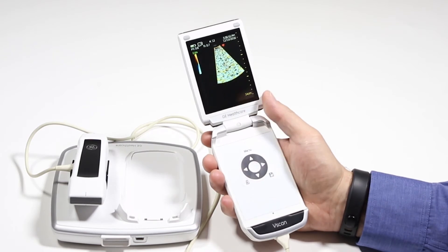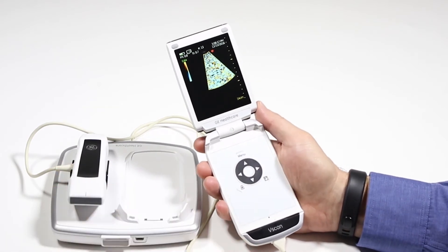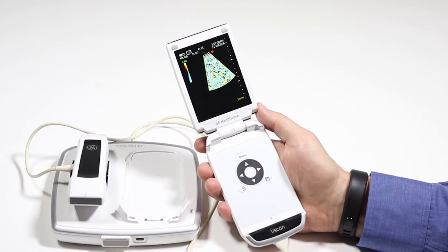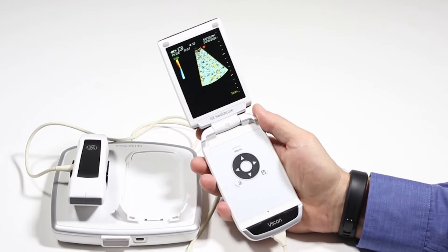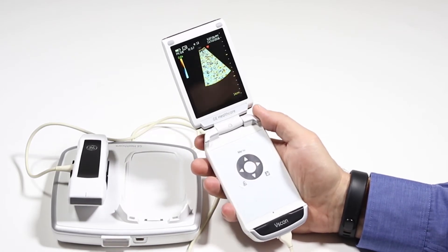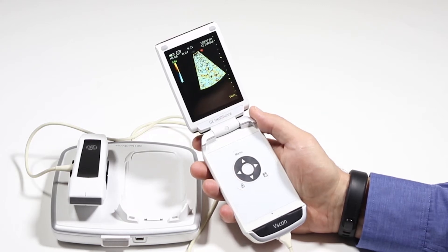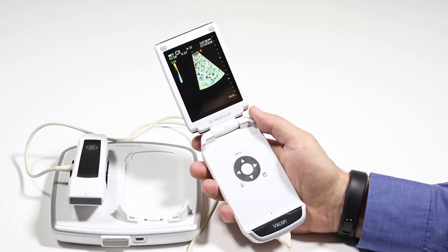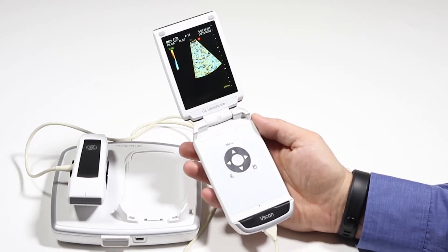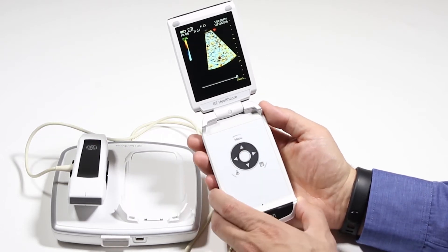Now if I'm scanning and haven't touched the system in a while, this machine will auto-freeze after a certain amount of time. You'll want to keep this on because it does get warm and it's set to prevent overheating — it's just a feature to help preserve the system.